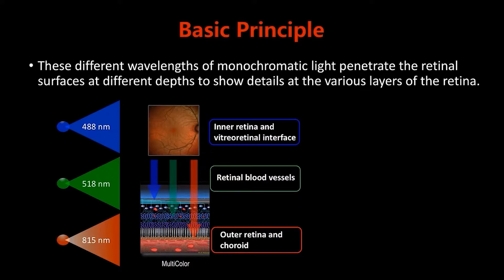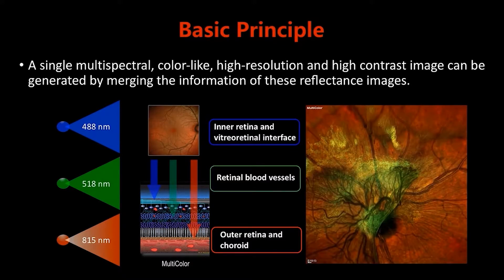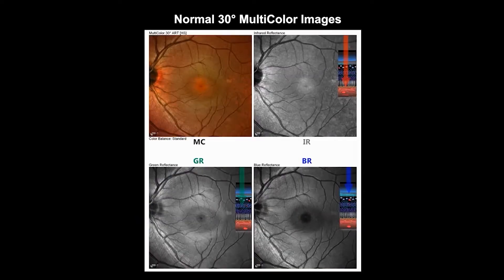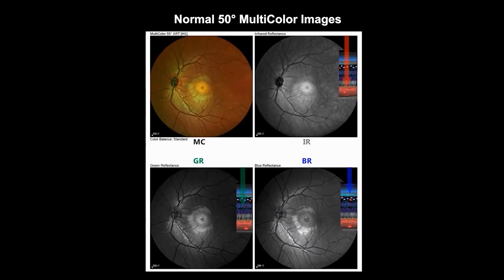The blue reflectance particularly enables details of the inner retina and vitreoretinal interface. The green reflectance images specifically allow deeper details such as retinal blood vessels and intra-retinal lipid exudation to be seen. Infrared reflectance predominantly visualizes structures at the level of the outer retina and choroid. This is a normal 30-degree multicolor image, and this is a normal 50-degree multicolor image.